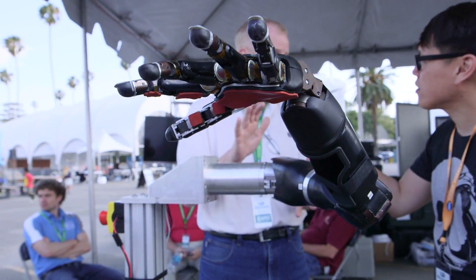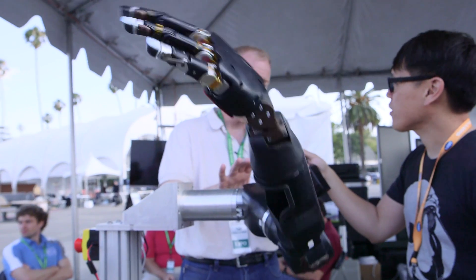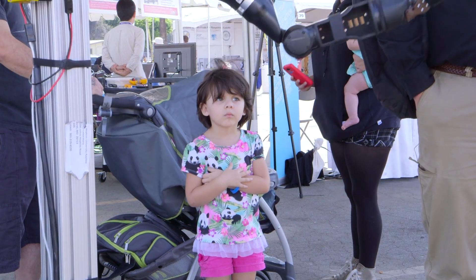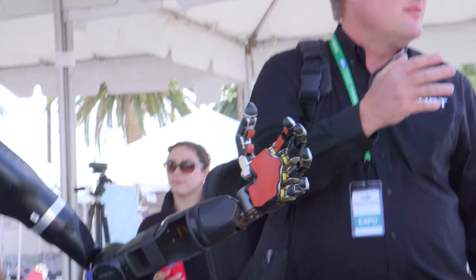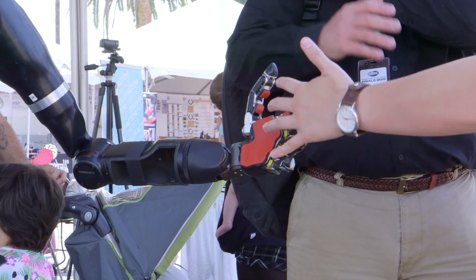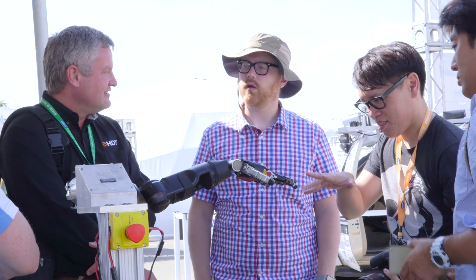We can also scale these things — take the same motor technology and put it in a larger form factor, and you have an arm that's much stronger than a human arm. It's going to be bigger, but it's much stronger. In fact, the Virginia Tech team is using a variant of those arms on its robot system. It's one of the few robots in the competition that actually has, in this case, a three-finger hand. But it was all based on this technology.